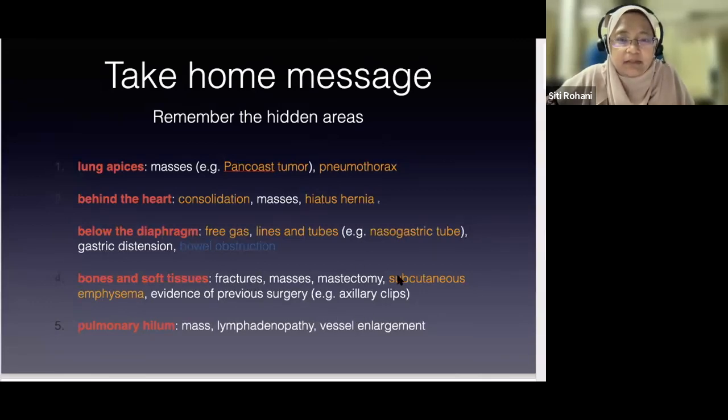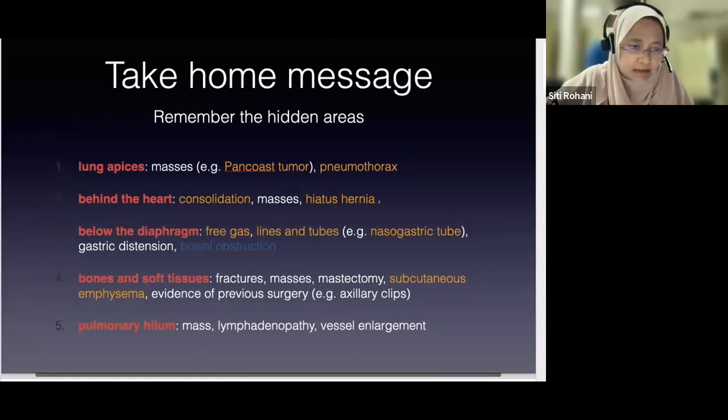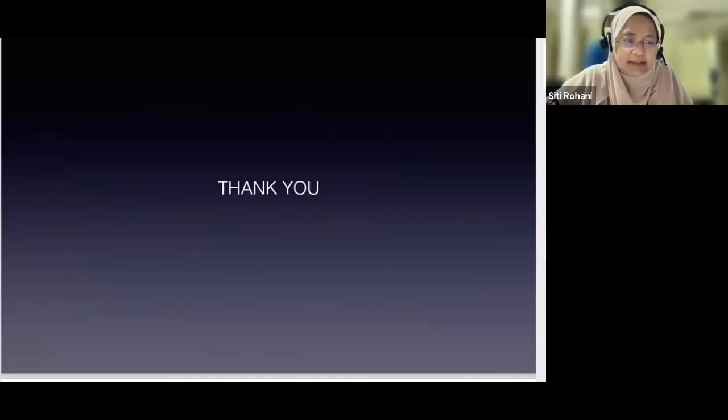Masses, mastectomy, which can give us some clue to the patient's condition, subcutaneous emphysema, or any previous evidence of surgery. And don't forget the pulmonary hilum, look for mass, lymphadenopathy, or vessel enlargement. Okay, I think that's my last slide. Thank you very much for listening.